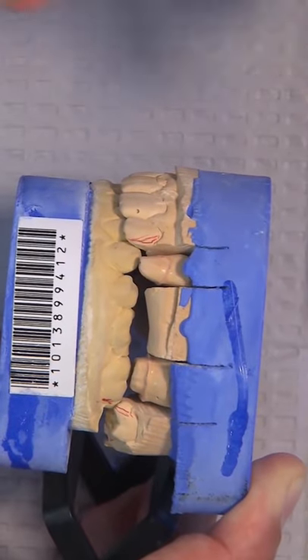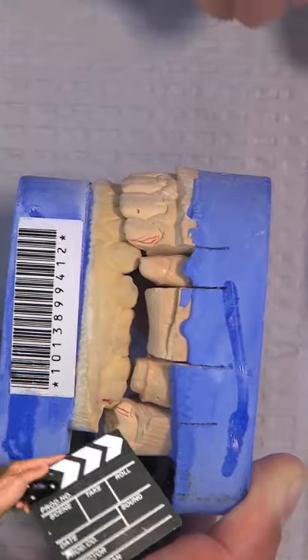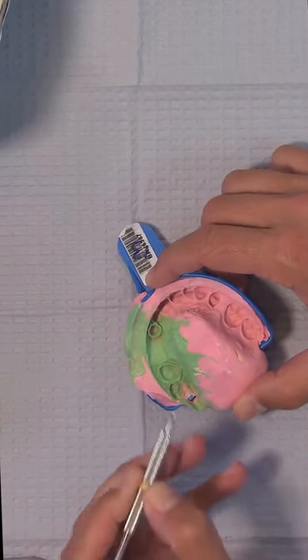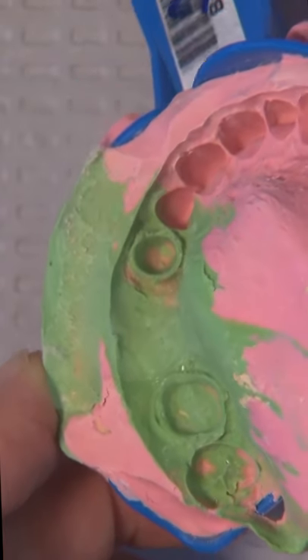that this bridge will not be able to be made as a BruxZir bridge and will need to be made as a porcelain fused metal bridge. On this case, the doctor has prepared a bridge from tooth number 11 to tooth number 14, and the doctor has requested a BruxZir bridge.